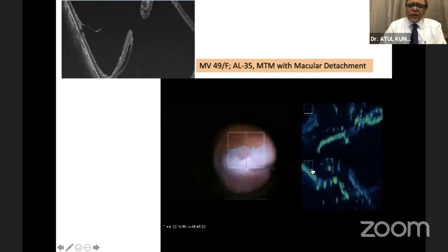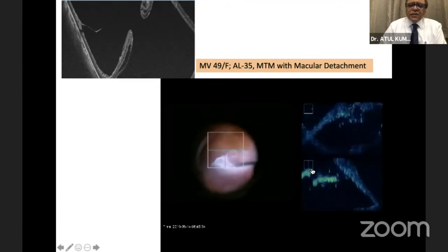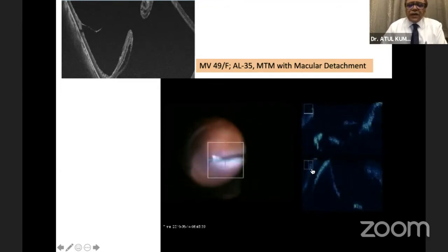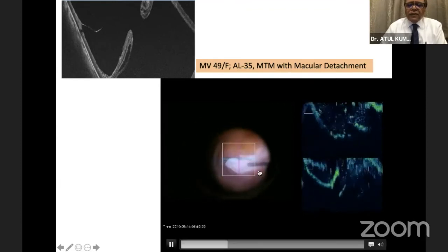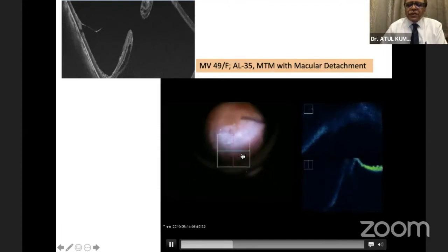So you usually have to manage with the existing instruments. You may take out the cannula, you may depress the sclera, or you may make the openings a little 4 millimeters. Definitely these eyes should be pseudophakic to get a better view. And even if it's a clear lens, I'd rather have them pseudophakic by an expert phacosurgeon.